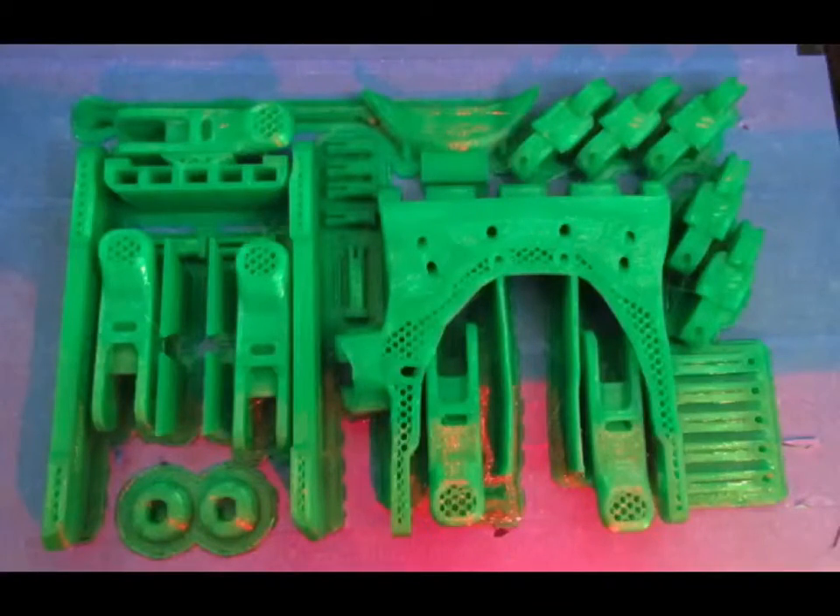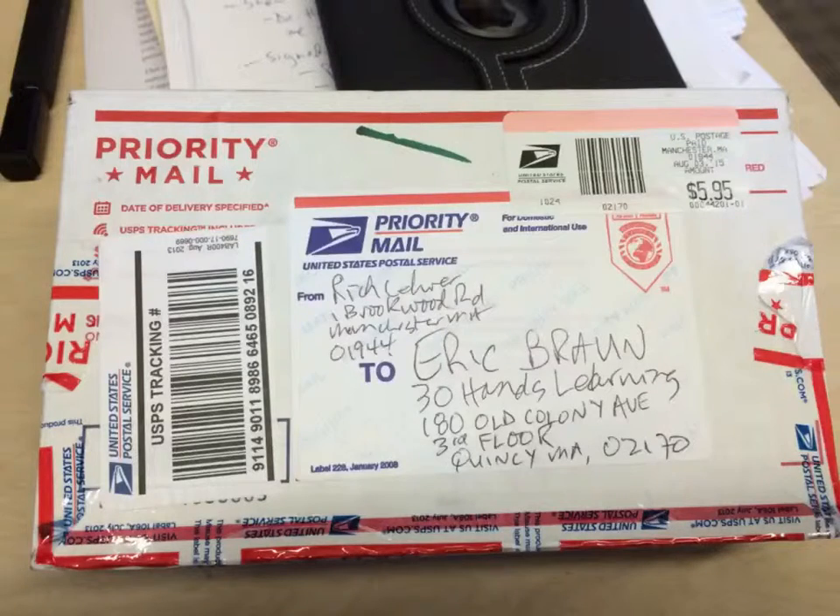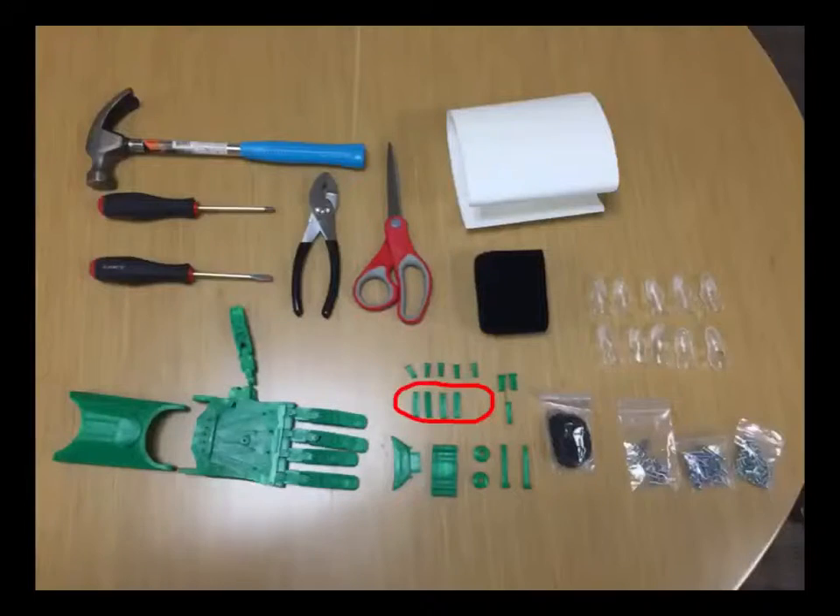And here's the finished product. So once we received the 3D printed parts, we got started immediately. If you look at this picture carefully, you'd actually see that we were missing one tension pin, but we decided that we would go ahead anyway.